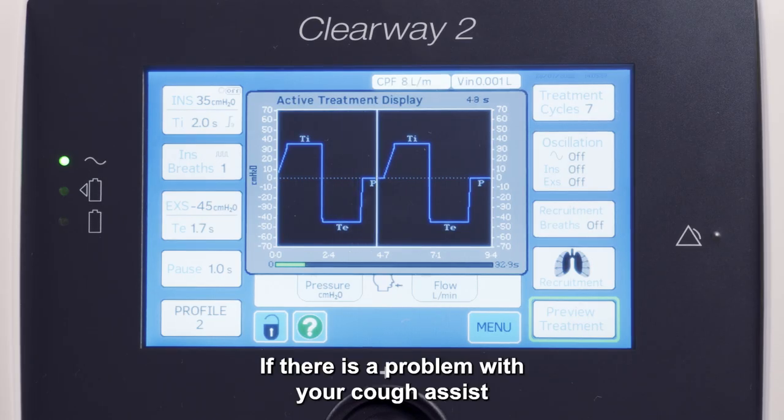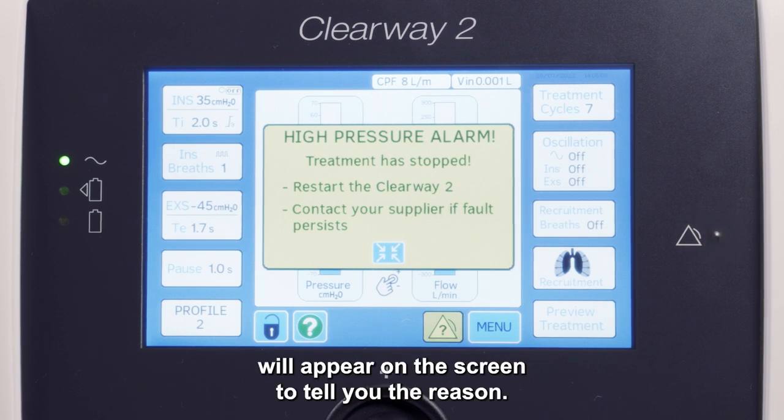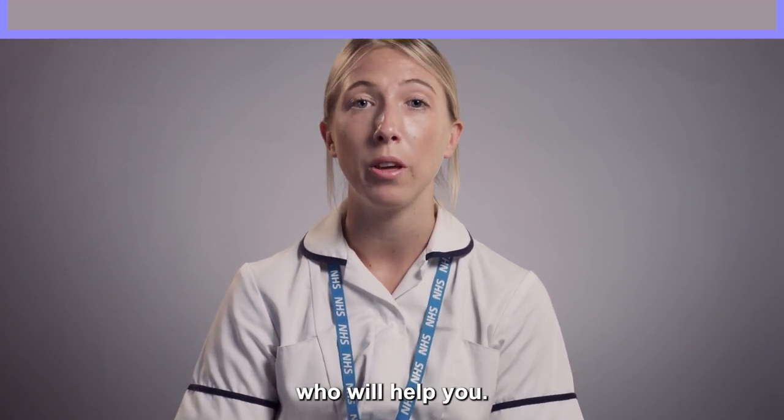If there is a problem with your Cough Assist, an alarm will sound and a yellow LED will flash. A message will appear on the screen to tell you the reason. If you are caring for someone, first check that they are okay. If you are unable to fix the problem, please contact the Home and IV Team who will help you.